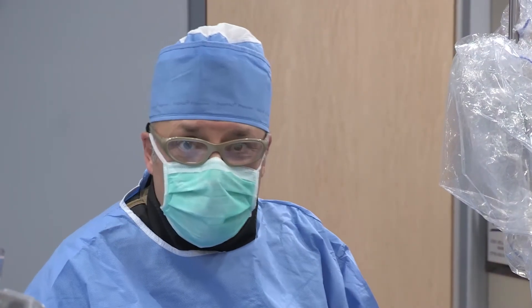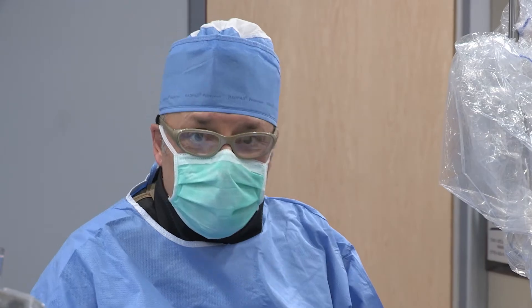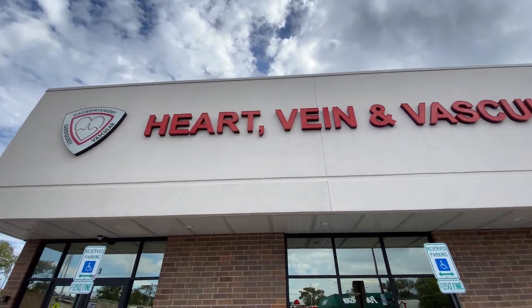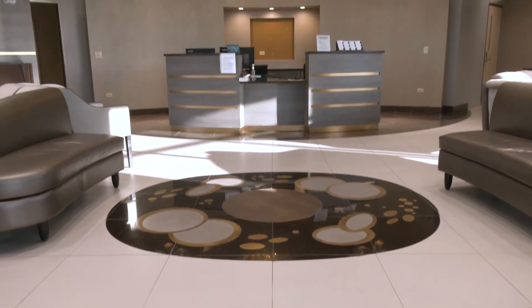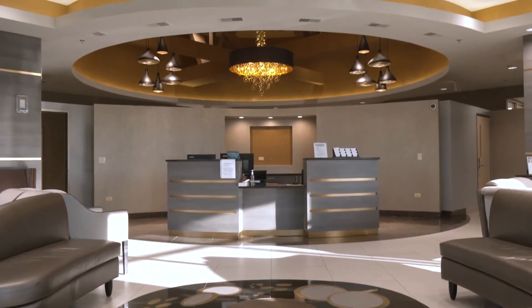Welcome to Consultants in Cardiology and Electrophysiology. We are located in the Chicago metro area. Today we are in our outpatient-based cath lab.